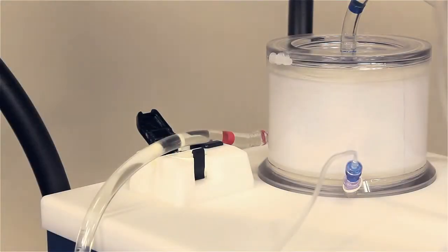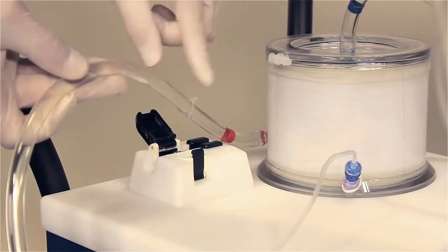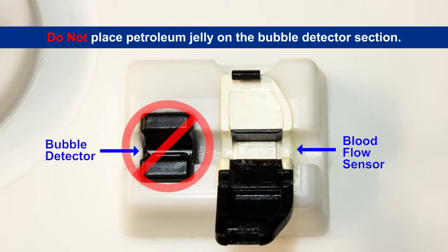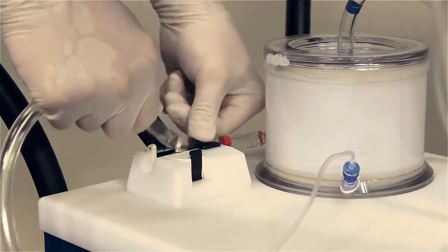Apply a small amount of petroleum jelly to the area of tubing that sits in the blood flow sensor. Do not place petroleum jelly on the bubble detector section. Seat the tubing into the sensors and close the door.